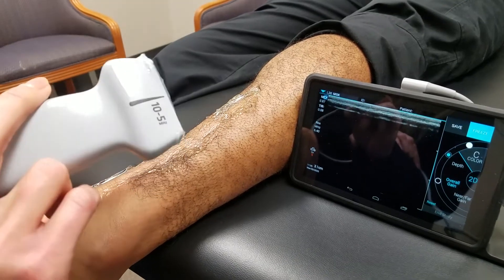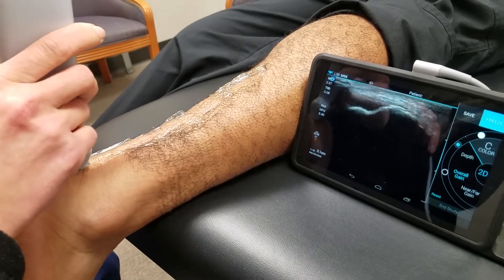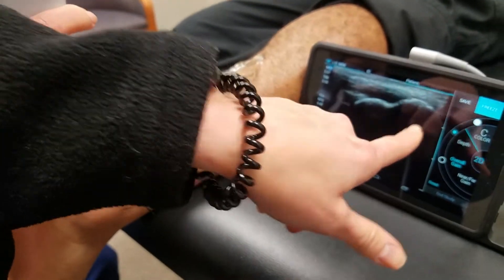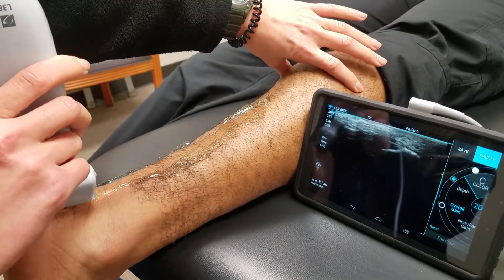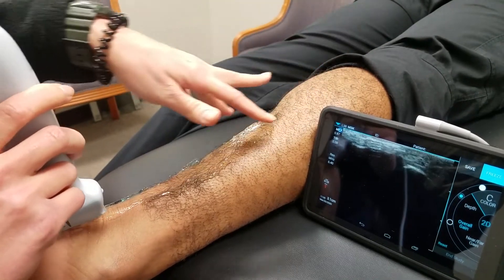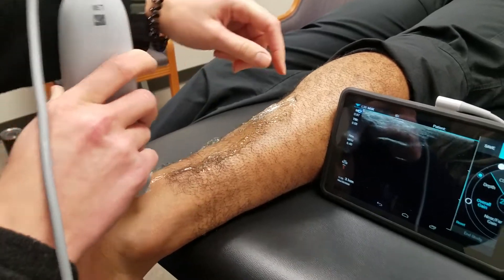We're going to look at the Achilles tendon with ultrasound. Starting right here, the first thing you're going to see is the calcaneal bone right in here. This Achilles tendon — which is your calf muscle, your gastrocnemius and your soleus muscles down here — they all connect and go down to the Achilles tendon right here that attaches to the calcaneus.